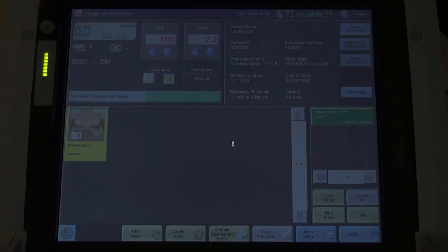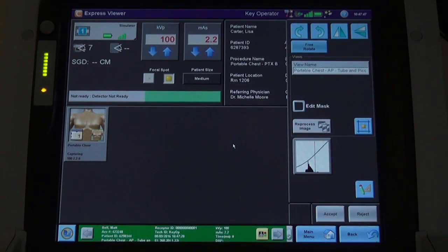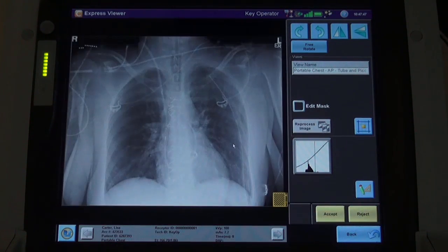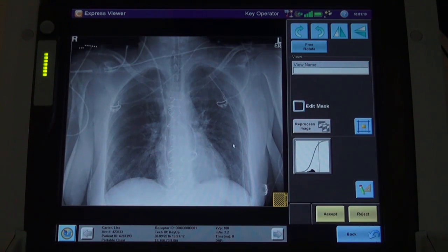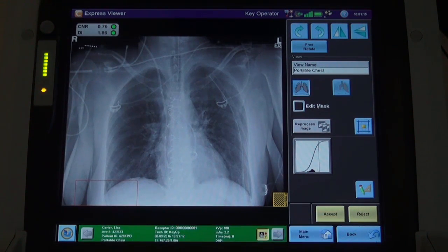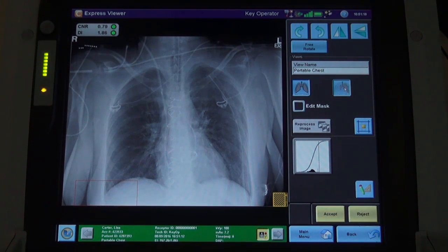The preview image of the chest appears within 3 to 5 seconds. Once the full resolution image is available, the radiographer selects the pneumothorax icon in the view pane.